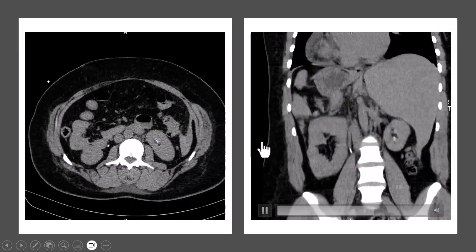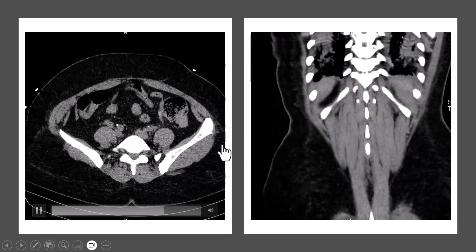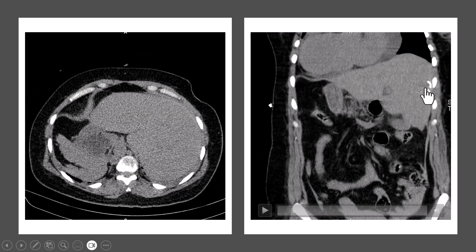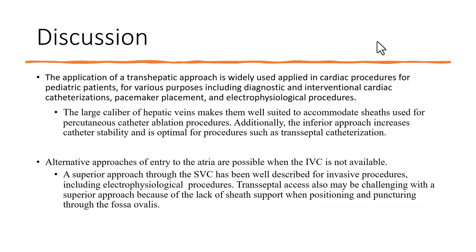Control CT scan immediately after the procedure and 24 hours later showed no significant bleeding. You can see the coils within the liver. The transhepatic approach is widely applied in cardiac procedures for pediatric patients and other diagnostic or interventional cardiac procedures. Alternative approaches to the atria are possible when the IVC is not available, and a superior approach through the superior vena cava has been well described for invasive procedures including electrophysiology procedures.